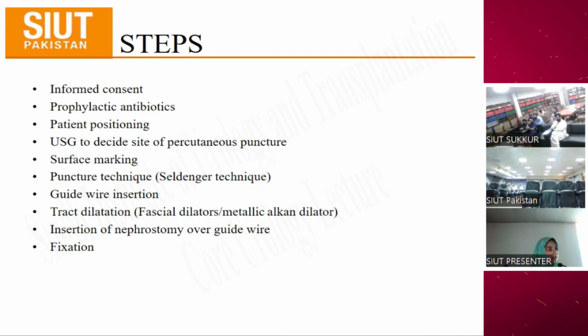So you enter the back end of the needle with the floppy end, and when the floppy end comes out of the tip of the needle, you have to know whether it has come out or not. How do you know it? Whether you measure the whole length of the needle, because maybe 1/3 or 2/3 of the needle is not in your vision. It is hidden since you have punctured the flat surface of the abdomen or the flank, and the rest of the needle is just going in.